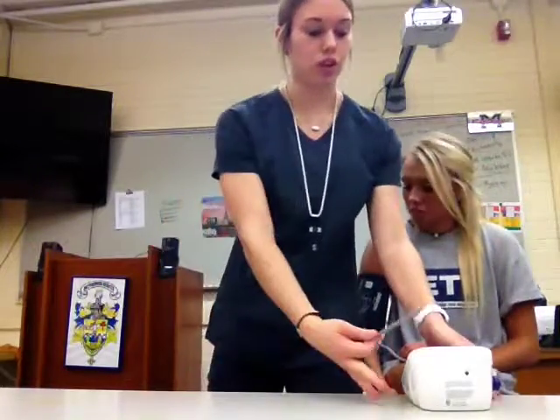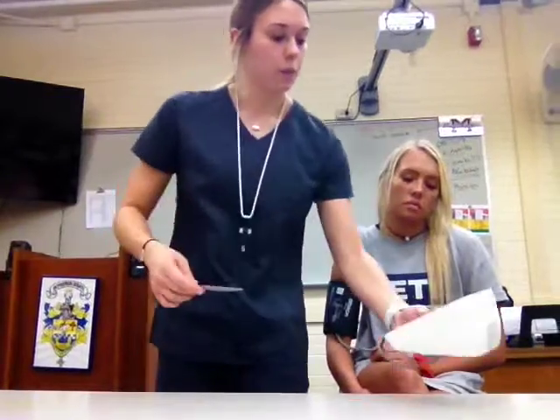A normal blood pressure should be around 120/80. This is normal because this is allowing your heart to not pump as much blood through your body. It's not working as hard to pump blood through your body, which is very good. Most athletes have a lower blood pressure just because they're more in shape. But yeah, her blood pressure is 117/74, very normal, which is good. Good job.